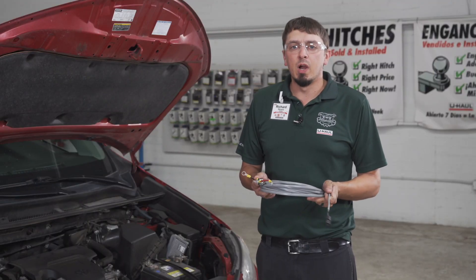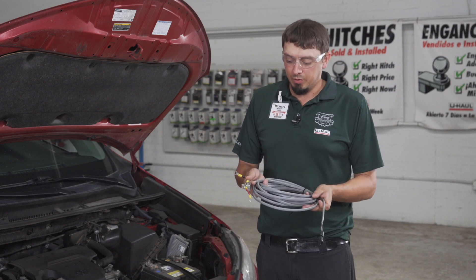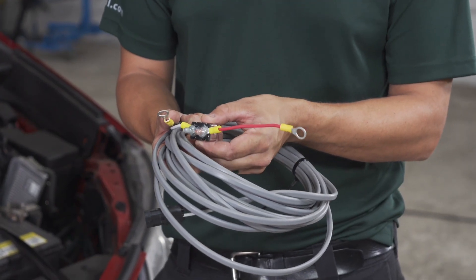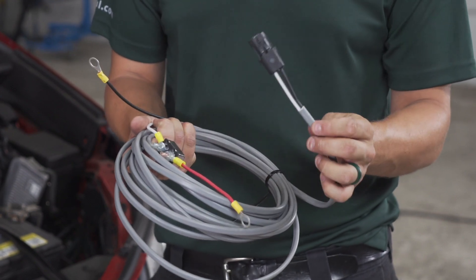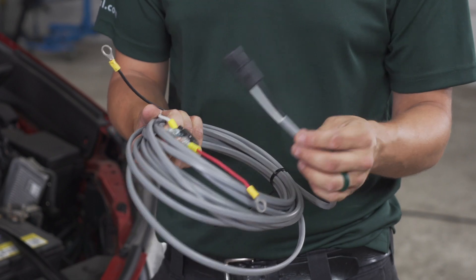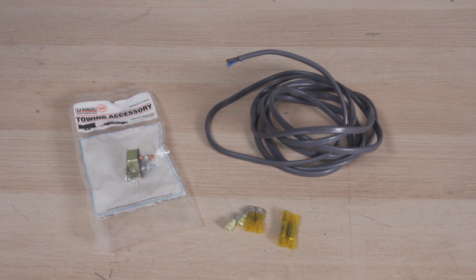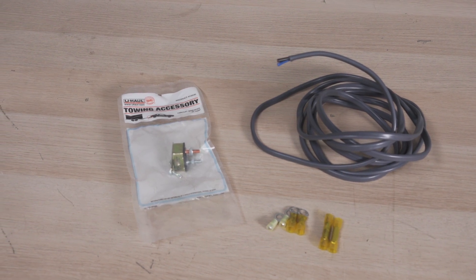Most wheelchair lifts will come with the wiring you need to complete your installation. A standard kit will look something like this. It'll have a power wire that has a circuit breaker, a ground wire, and then it'll come with a plug that fits into your wheelchair lift. If your wheelchair lift does not come with the wiring kit, you can go to your local U-Haul for all the necessary parts except for the wheelchair specific plug.